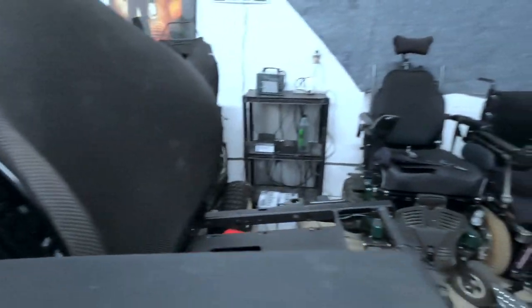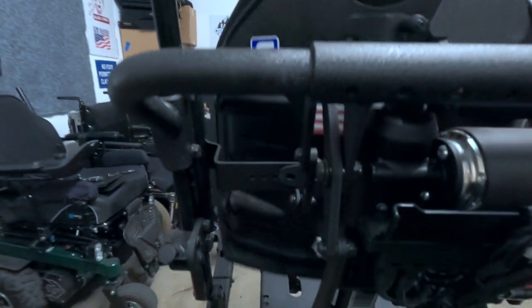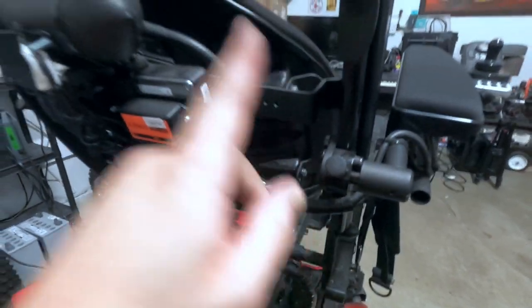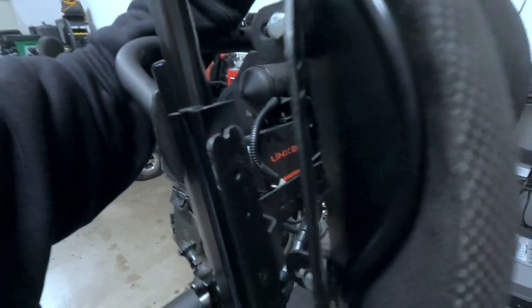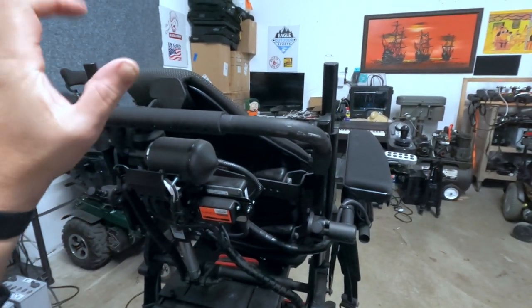It looks like our brackets are going to line up. I put a couple of screws back in the crossbar just to hold everything up, and it looks like we are in spec on both sides — so we're going to call it a half inch. I'm going to get all this hardware put back in on these crossbars and up here, and then see if we can bolt this backrest on. We do have some slots so we can play with the distance just a little bit. Holding this up it looks like it'll work. One inch wider overall — let's lock everything back down.